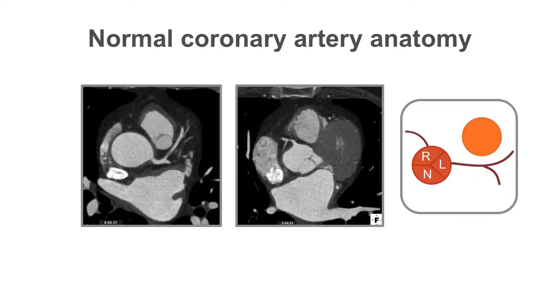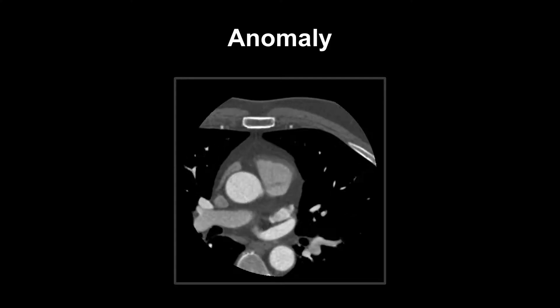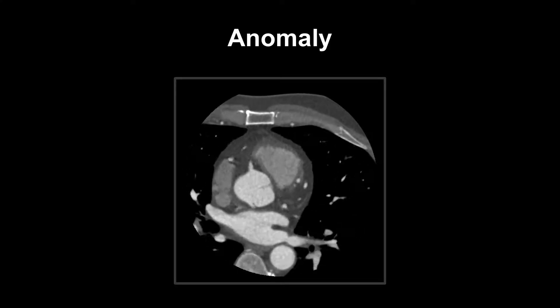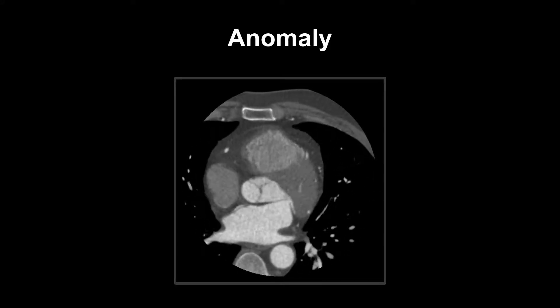Here we can see the two origins: the left main stem from the left coronary cusp and the right coronary artery from the right coronary cusp. This is a normal anatomical arrangement of the coronary arteries. Let us now look at a coronary anomaly.